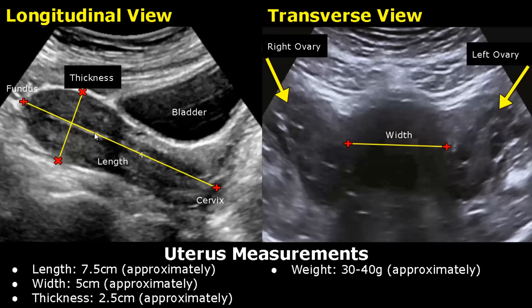In the longitudinal view, we can measure the length and the AP thickness of the uterus. One caliper is placed at the top of the fundus and the other caliper is placed at the base of the cervix.